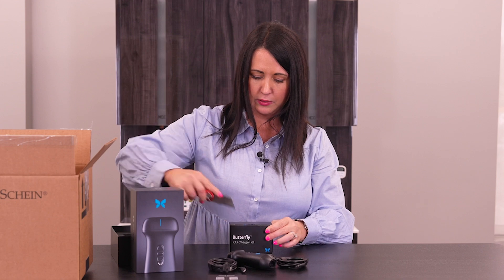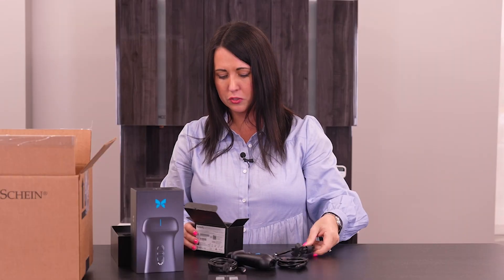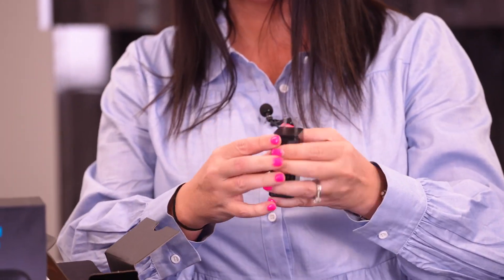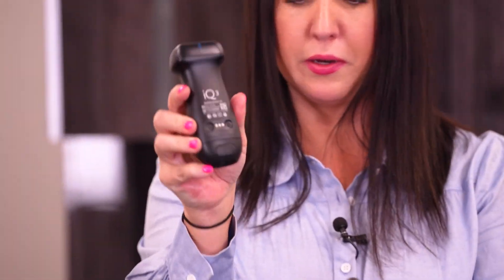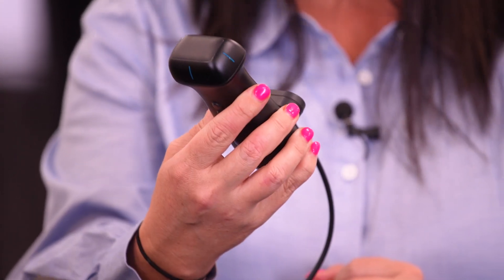Let's take a look at the charging kit. So this looks like it's an actual charger, and we will need to slide this in to be the plug for the wall. These two little spots right back here is right where you will plug this in, and it just clips in with a magnet, so you'll be ready to go.